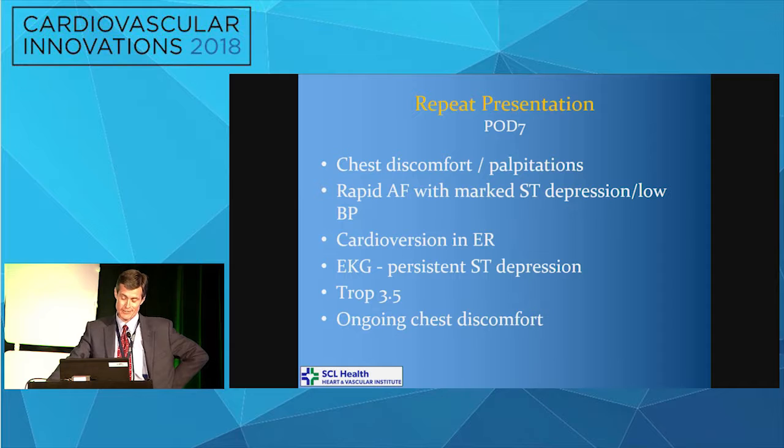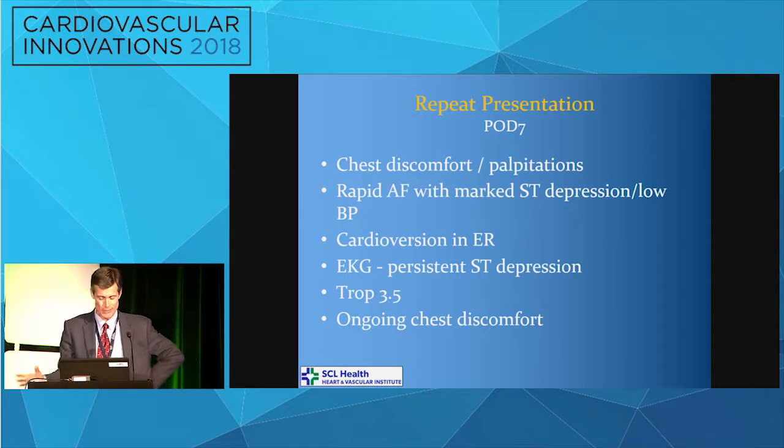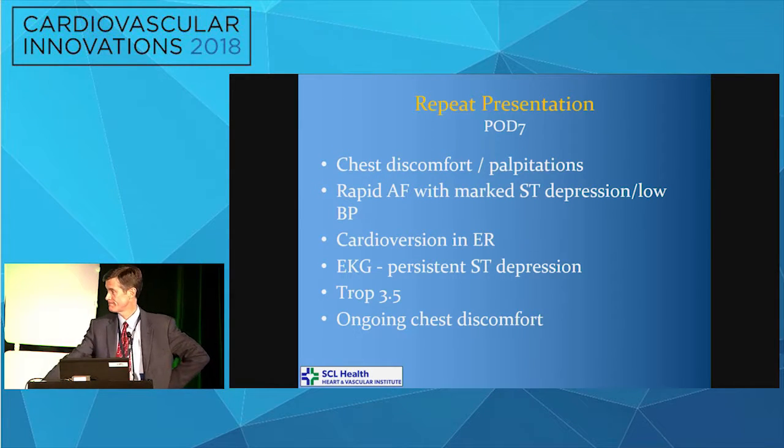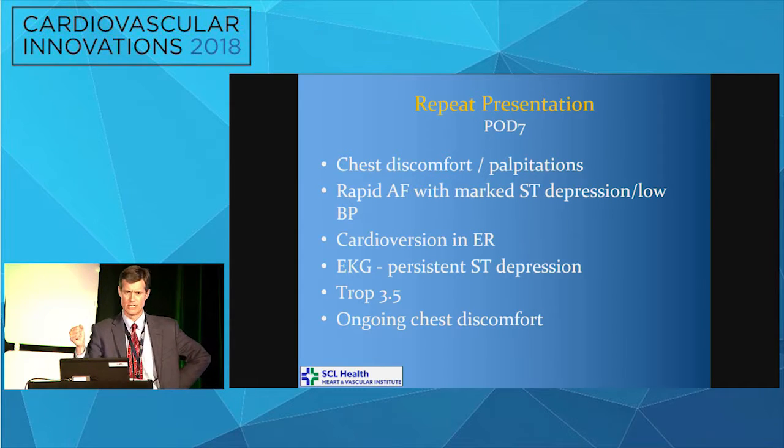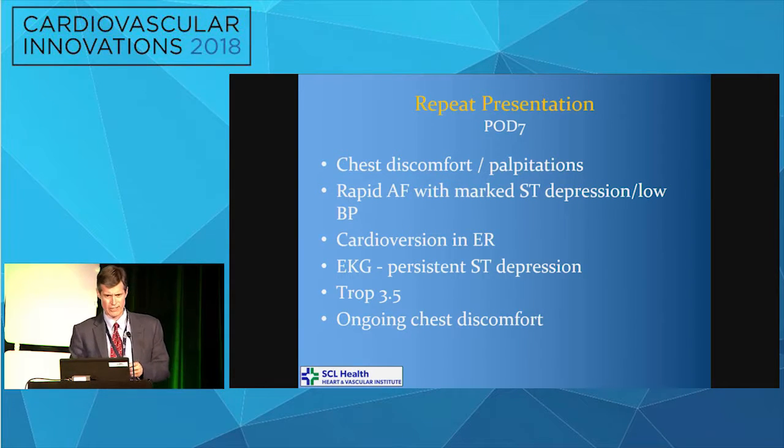Well, and I think we would do this a little differently this time. We did manipulate the valve a lot. You had no concerns, right? We weren't concerned, but that was naive. And I tell you, our conclusion was, look, left ventricular function's fine, ST segments are fine, the guy hemodynamically is fine, transvalvular gradients look good, and we thought, okay, one of the many coronary takeoffs that you worry about, and frequently we protect. In this case, we didn't, but it seems that protecting means that you don't have to do anything and you pull everything out at the end of the case.